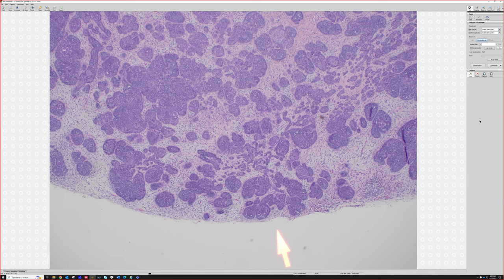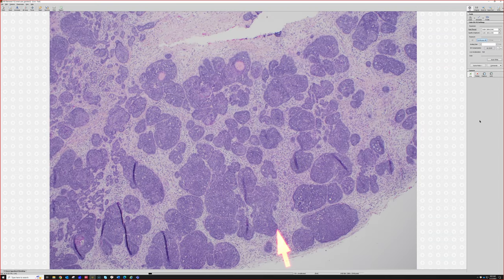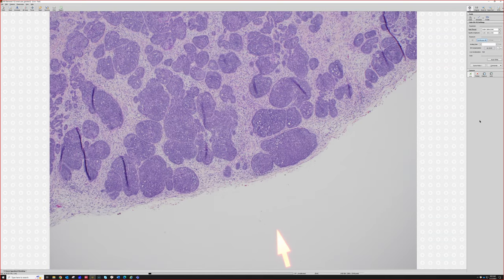But this is good, and I've got another one on my Kiko page, my DermPath directory. I'll have a link down below if you're watching this online. Go to that page, Control F or Command F, and search for trichoblastoma. I've got a digital slide of one, a different pattern than this, but you can still see just like this, it's got this ball of stroma. All the basaloid islands are encased in this ball of cellular stroma and it is completely sharply circumscribed and distinct from the surrounding tissue. I find that really useful because that's not how basal cell grows, not in my experience.